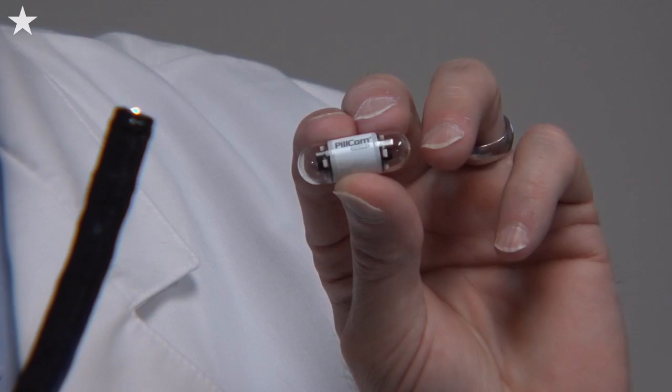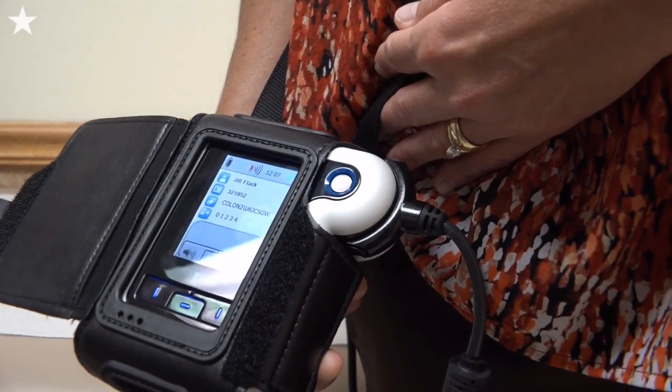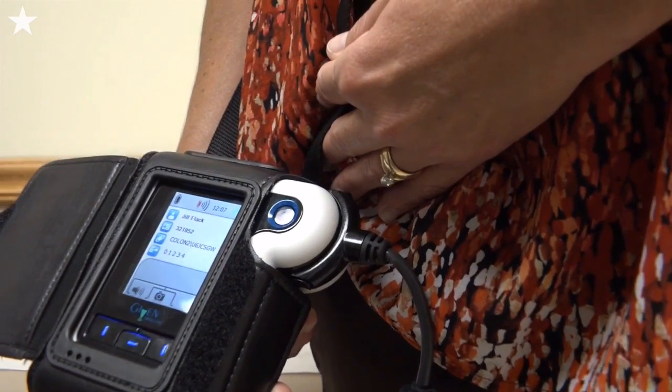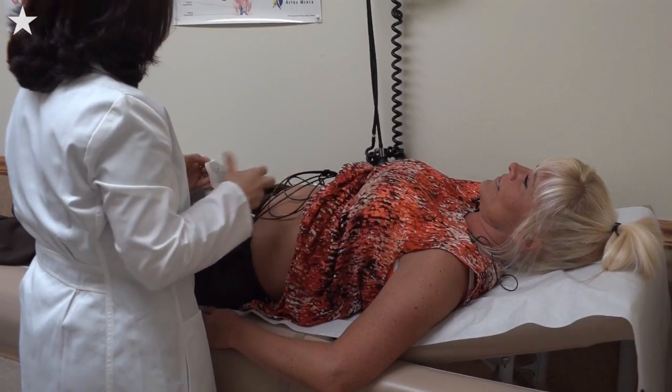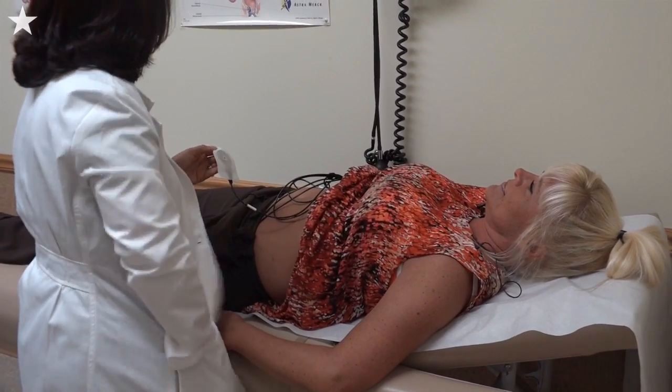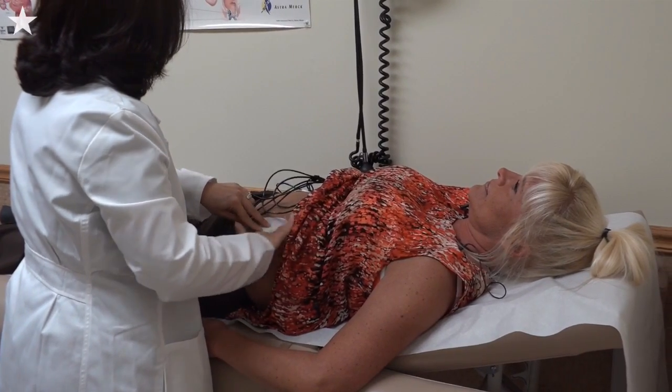We look for abnormalities, and we can take samples and biopsies. This is the entire camera — the scope that we now use — and they have miniaturized this colonoscope into a pill. Everything inside — camera, recorder — sends images out to a recorder belt via leads placed on the body, kind of like EKG leads, which record the images and impulses.